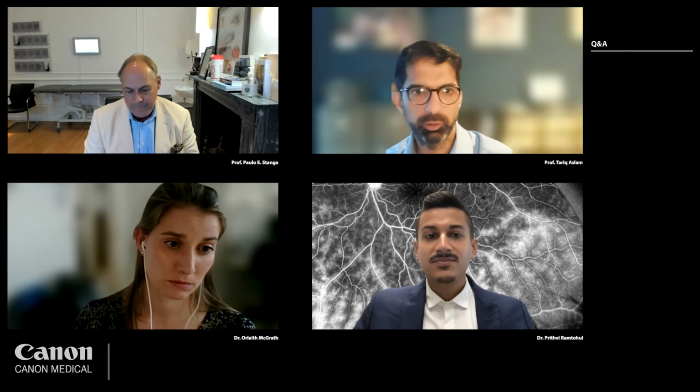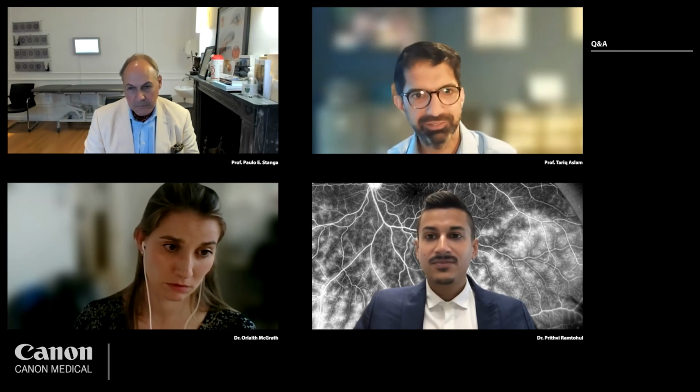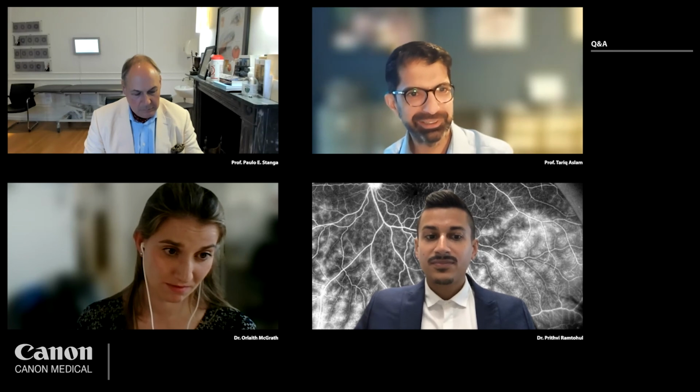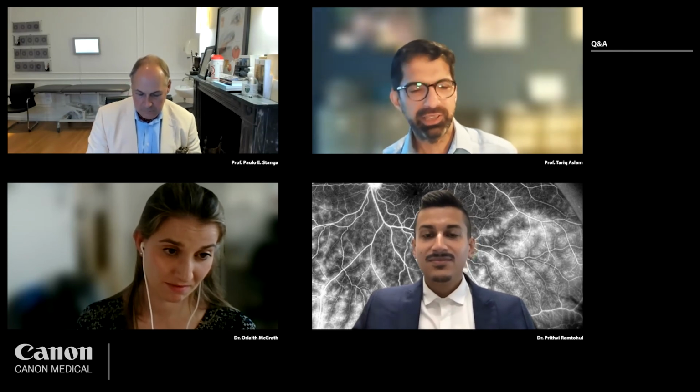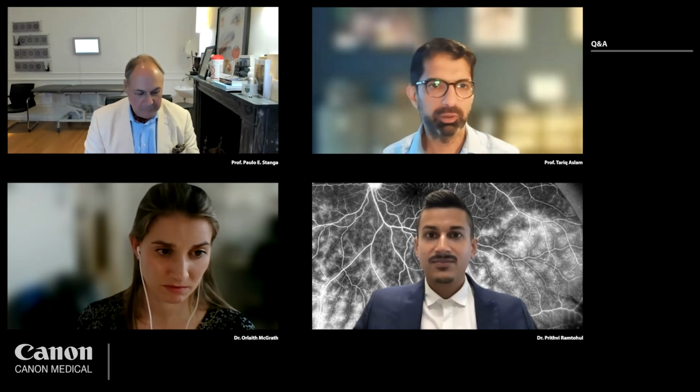One is to use the automated system of image quality to ensure that there was good image quality in all images taken. But then also sometimes you do see floaters even, don't you? And if you take a single image, you can get little dark areas in that image. And this is just something we realized later on, that the software was finding areas that it thought were ischemic, whereas actually it definitely wasn't. And we could see when you're taking the image that these things were moving. So we incorporated aspects into the software to try and counteract those different artifacts that came up as well.